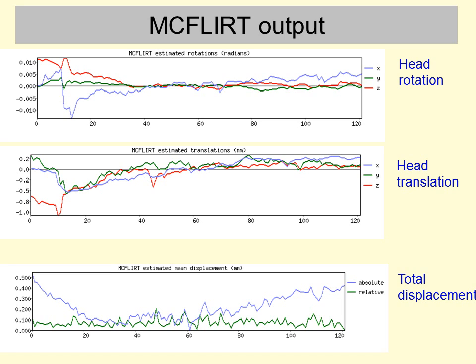And the first thing I always do when I get one of these plots is I just look at the range of values on the y-axis, because like most bits of statistical software, FSL likes to rescale the range on the y-axis to make any differences that are present highly visible on the graph. So that can make very small differences look big if you're not aware of the fact that the y-axis has got a tiny range on it. So the range on the y-axis in this case goes from 0 to 0.5 and the units are millimeters.